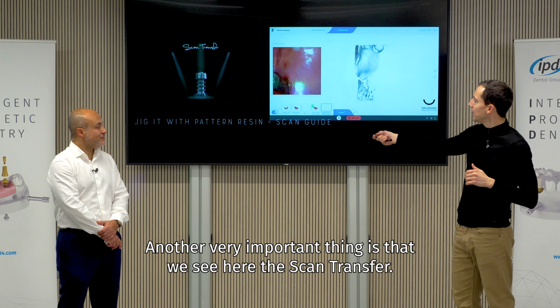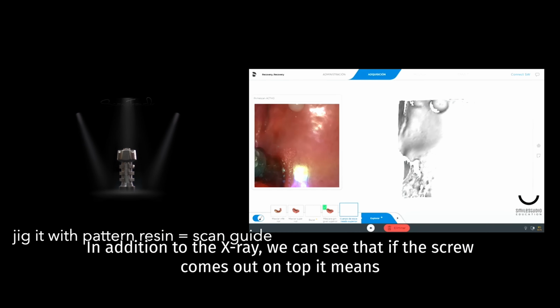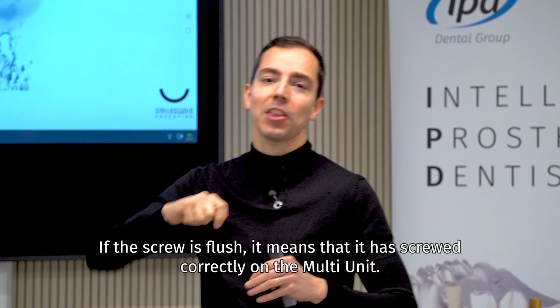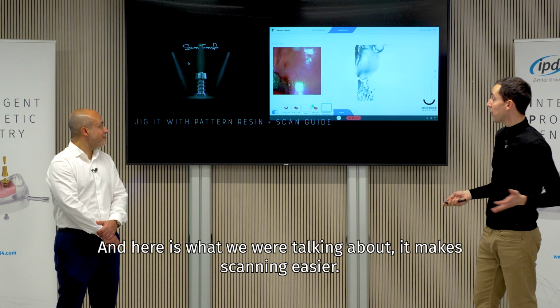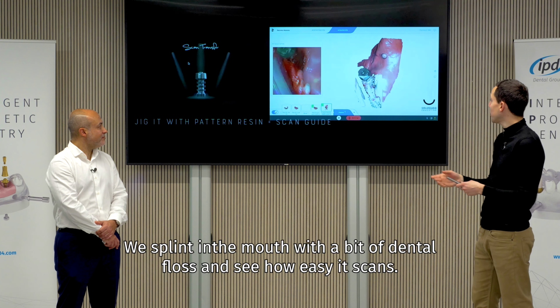Another very important thing is that we see here the scan transfer. In addition to the X-ray, we can see that if the screw comes out on top, it means that it has not been adjusted perfectly. If the screw is flush, it means that it has screwed correctly on the multi-unit. And here's what we were talking about. It makes scanning easier. We splint in the mouth with a bit of dental floss and see how easy it scans.